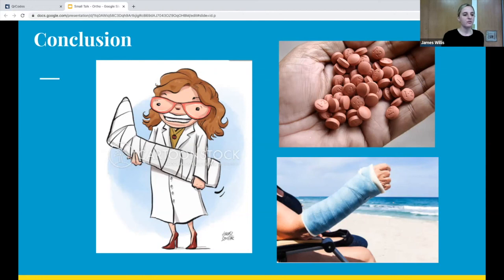It's also helpful in the cases of supracondylar fractures and nursemaid's elbow to distinguish between the two pathologies and to help guide treatment. This is not at all saying that we're going to abandon X-rays. I think ortho would absolutely freak out if that was the direction we're going. It's just something that you can keep in the back of your mind to help you when you're in a situation such as this one.